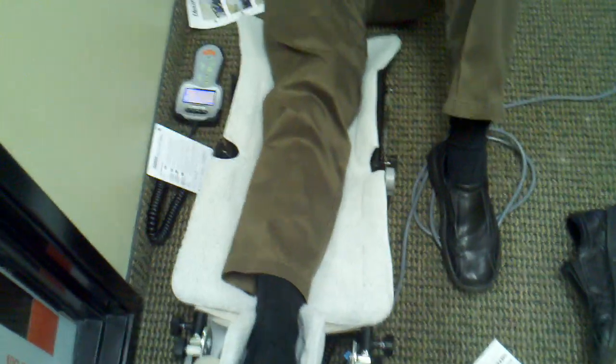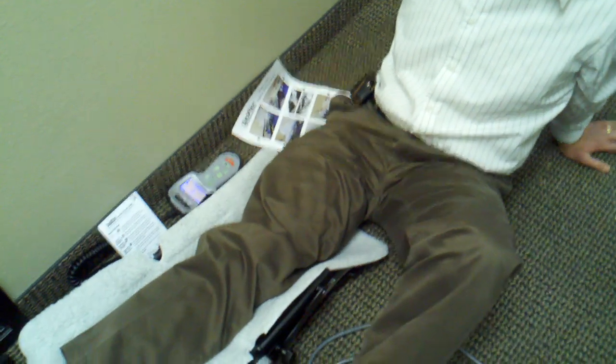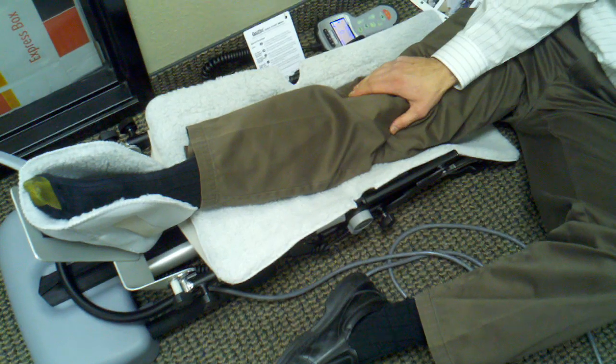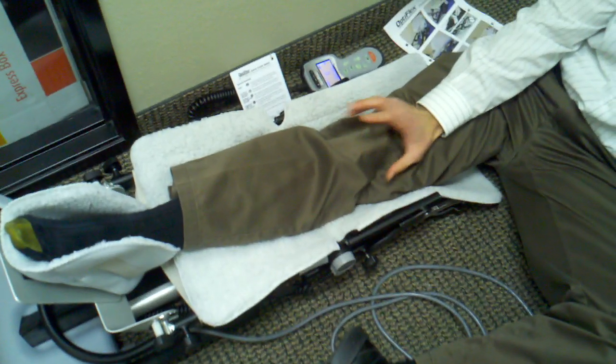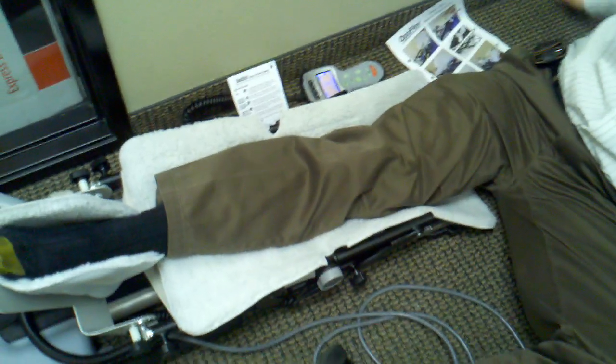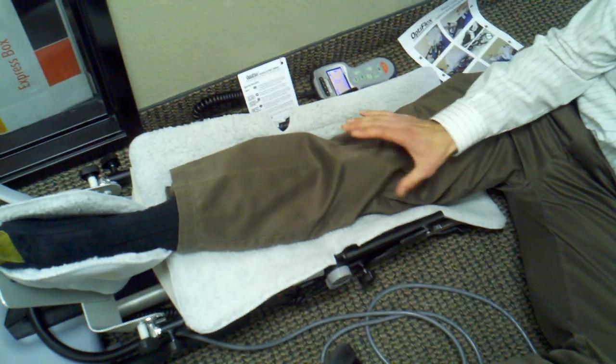What is this machine? This is a continuous passive motion device. It is usually used for individuals that have had a total knee surgery or some kind of knee surgery where they need to be able to move their knee in a range of motion that allows them to prevent swelling and prevent increased pain. A lot of times individuals have a hard time moving their knee on their own because it is painful, so they'll put themselves in a device like this and set it up so their joint is aligned in the machine.